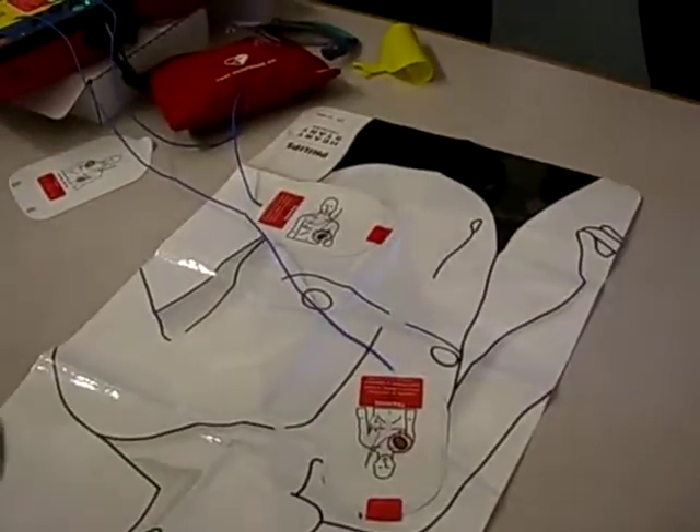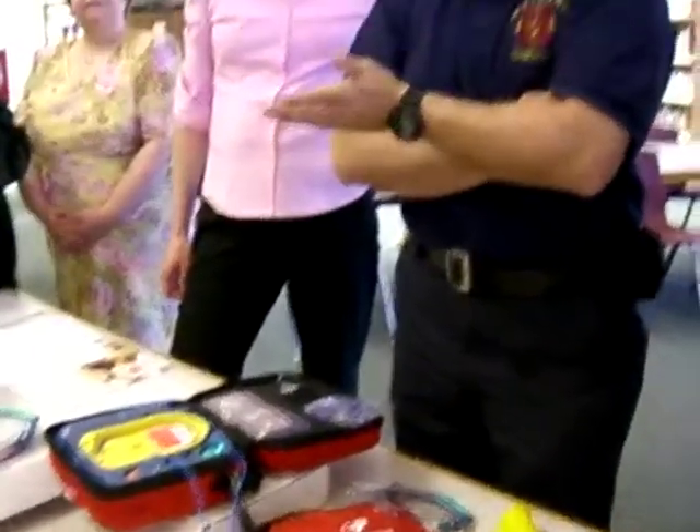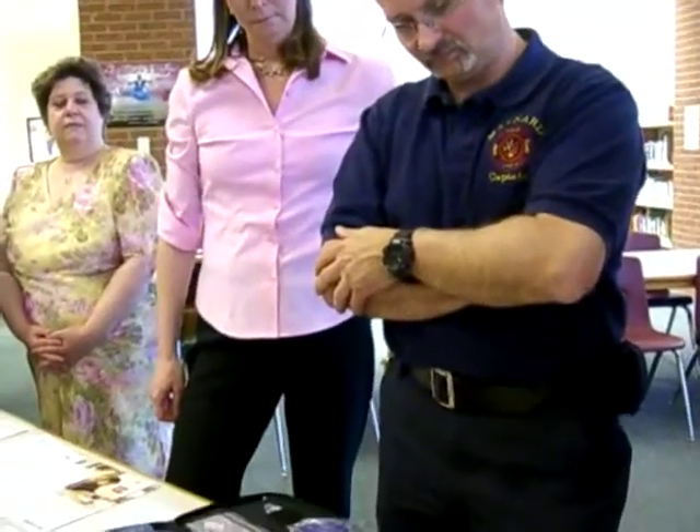Press firmly to the patient's bare skin. No one should touch the patient. Now the machine is going to start analyzing — it's a computer that analyzes the heart rhythm for you. No one should touch the patient. Analyzing.